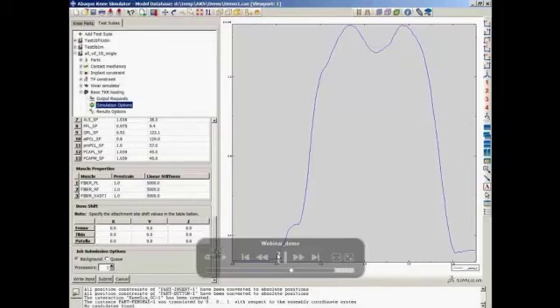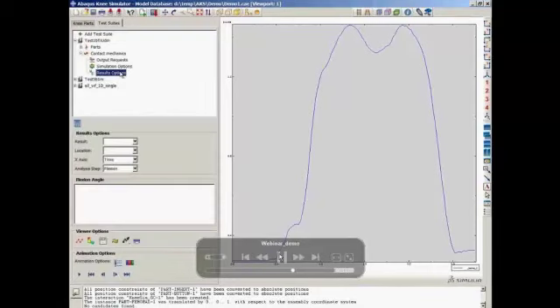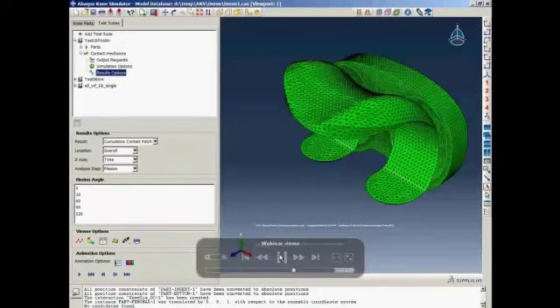Next, we demonstrate the visualization part of these workflows. So we use an existing workflow that has been executed by one of our interns here, and she has picked specific simulation options and output requests for me, and when we click on result options, the ODB will be populated.